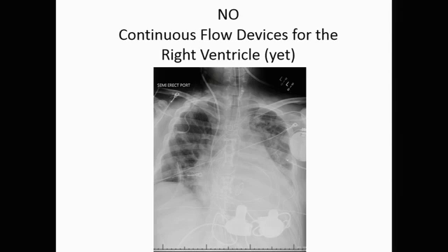I will point out as well that there are no continuous flow devices approved for the right ventricle yet. This is important because in many of our patients, their RV isn't much better than their LV, and sometimes it's just as bad.